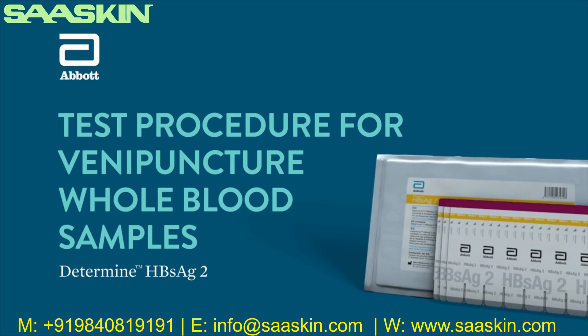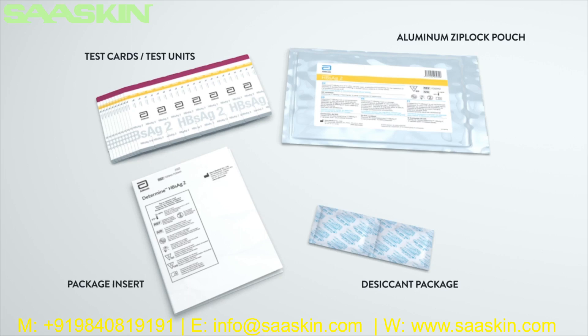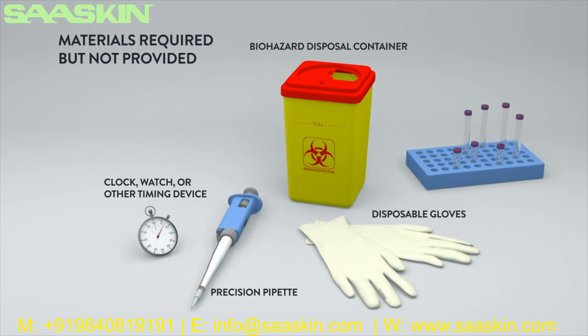The Determine HBsAg2 test procedure training for venipuncture whole blood samples. The Determine HBsAg2 test is a visually read qualitative immunoassay for the detection of hepatitis B surface antigen (HBsAg) in human serum, plasma, or whole blood. Each hepatitis B surface antigen kit contains one aluminum Ziploc pouch containing either 20 or 100 tests, a desiccant package, and package insert. Chase buffer is provided but separate to the kit. Materials required but not provided: clock, watch, or other timing device; precision pipette capable of delivering 50 microliters of sample with disposable tips; disposable gloves; biohazard disposal container; and collection devices for specimens other than finger stick whole blood specimens.